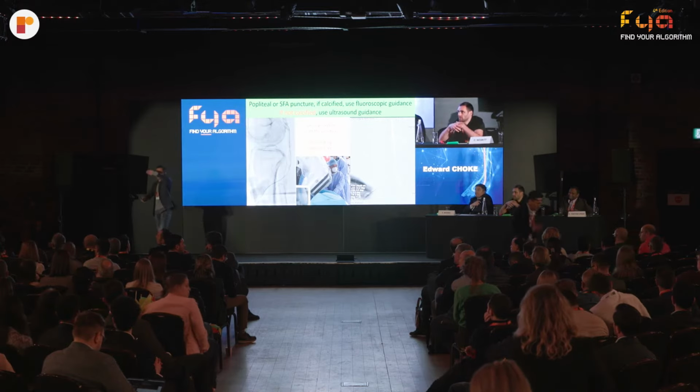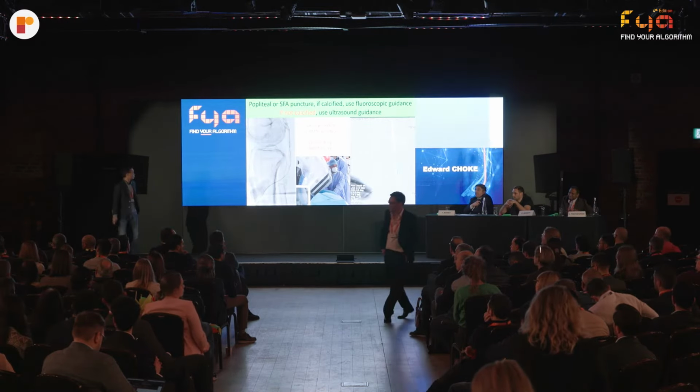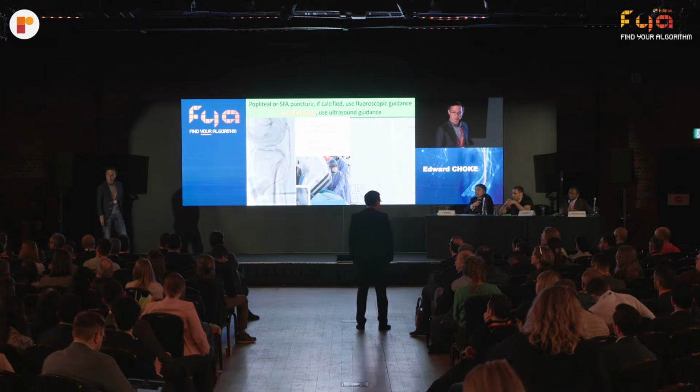Hi. Barry from Leicester. It is a real issue for us, especially in the UK, maybe everywhere, because we will be putting in a lot of reviews for these kinds of images if they are shown in the MDT. If we have our fingers like that, we have now started to use lead-covered gloves. So leaded gloves may be useful. But many times when we use our fingers in there, I get shouted at. My radiographer shouts at me. It will be reported straight away.